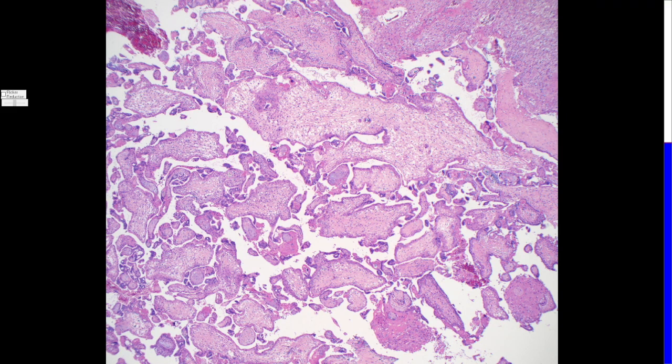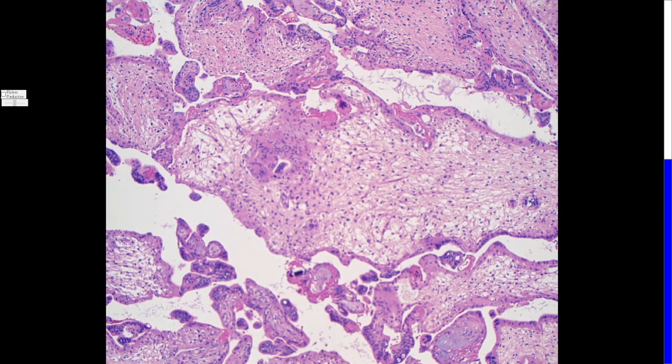Well, first of all, we have some villus enlargement, like this villus here. One of the main characteristic features is irregular contours. And how do I tell? Well, you see how the trophoblast is kind of growing in the villus right here. So that's the type of irregular outline you want to see. You also see these knobs. You see, like, the stroma is kind of growing out of the villus in a way, like here too. So when you start seeing a lot of it, you start suspecting this is potentially dysmorphic.